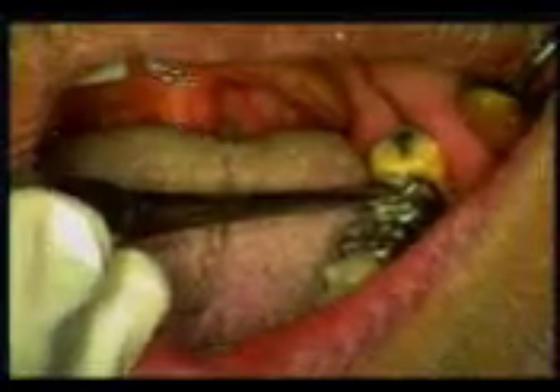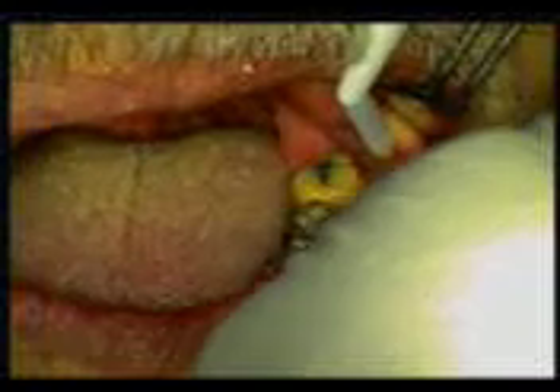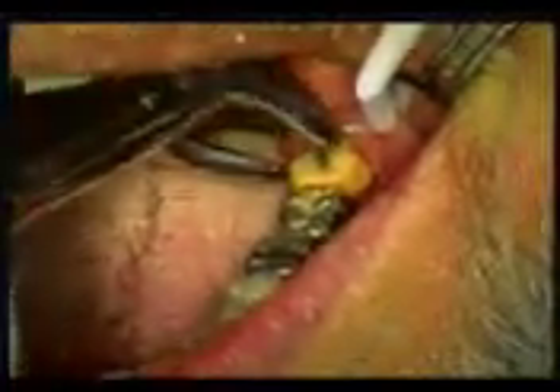I'm concentrating on number 18 because I don't want to pop that thing off — even though my consent forms talk about that. You just don't want to break that adjacent tooth or break it off. I've got some movement going on right now. The roots are somewhat split but not much. So I can go with a 23 or a 151. I've got three forceps in my office: 150 for the uppers, 151 for the lowers, and a 23 for the lower bifurcated roots.